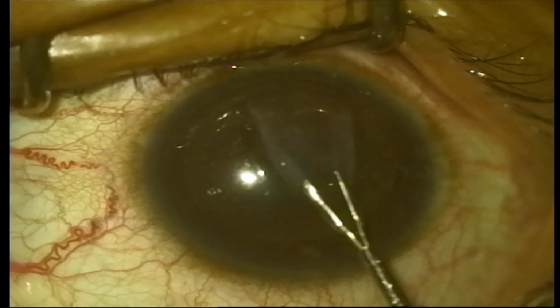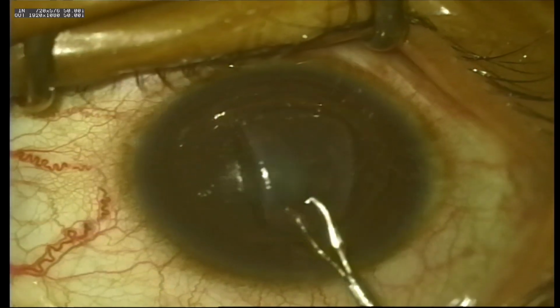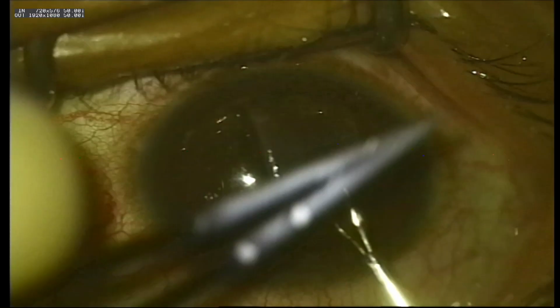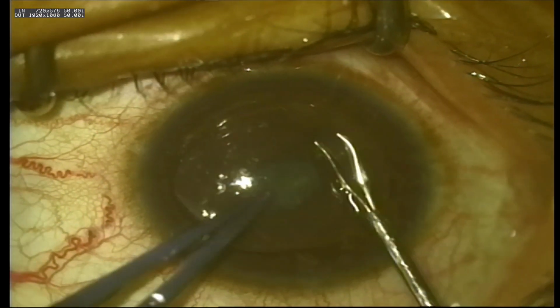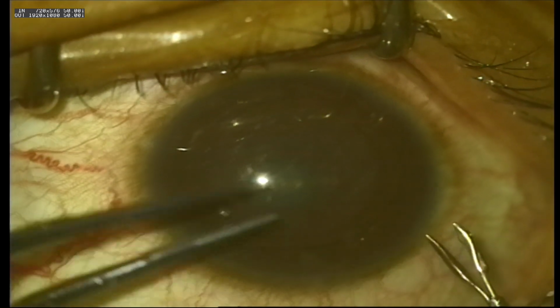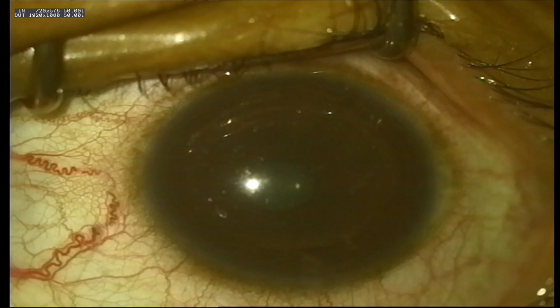Give me just a McPherson or something, anything, forceps. You can just spread it, though it's not needed to just spread it on top of the cornea to see that it's a complete lenticule. So you can see that's a complete lenticule that has been removed, and give me a wash.